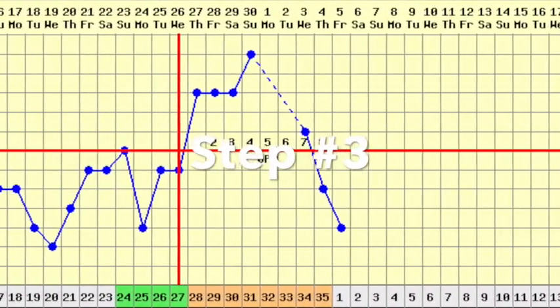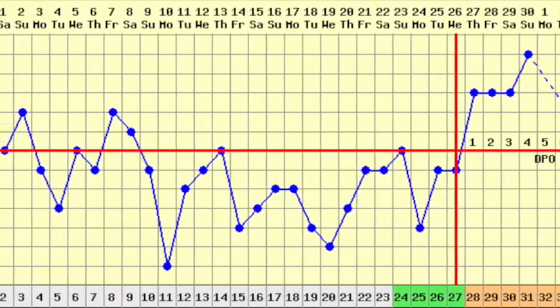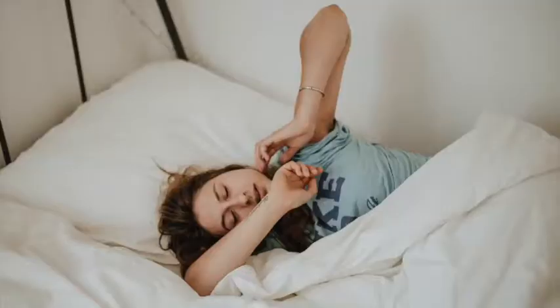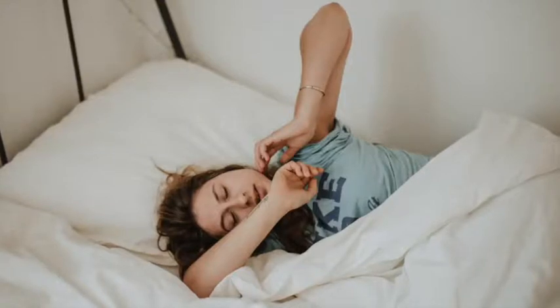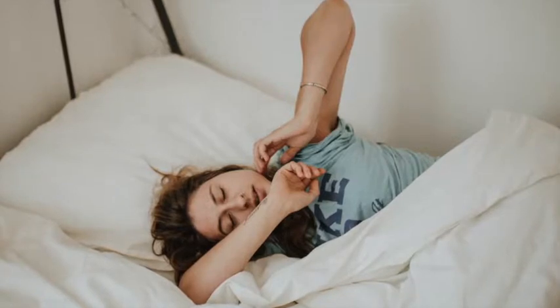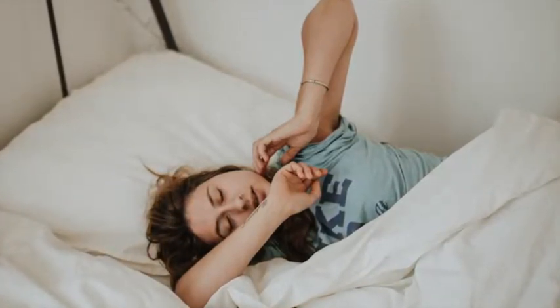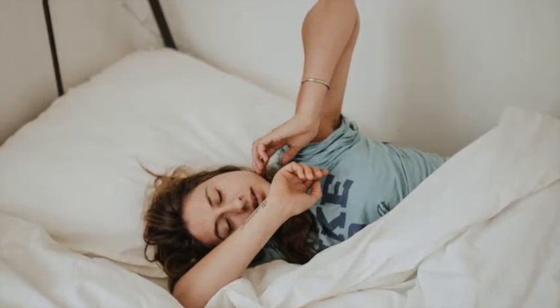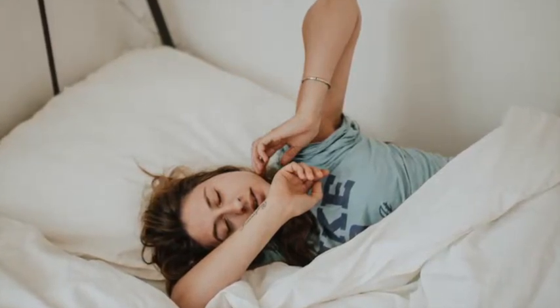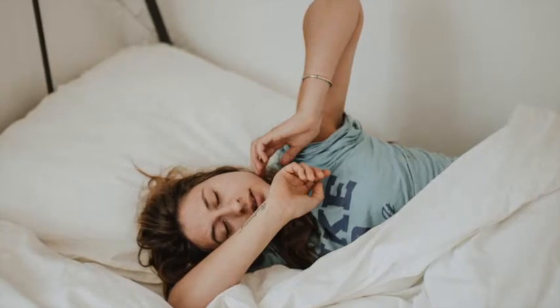Step three: record the temperature, the time, and the date. The closer you get to the exact same time each morning — whether that's 5 a.m., 6 a.m., or 7 a.m. — the more accurate your results will be. It's really crucial to record your results at the exact same time every day, and you want to do this for at least three mornings to provide a good average to work from.